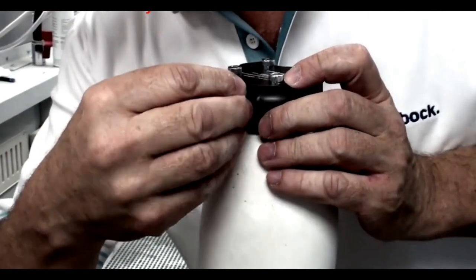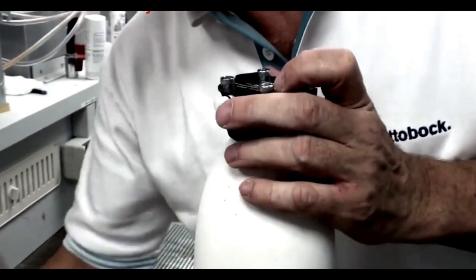Take the lamination dummy for the expulsion valve and screw it in place.